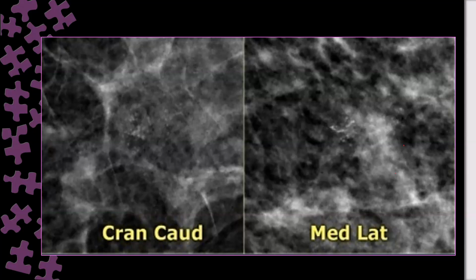But on the craniocaudal, it is amorphous. How it is the same? Can you characterize it in the medial lateral view? Does it look the same? Or it changed?